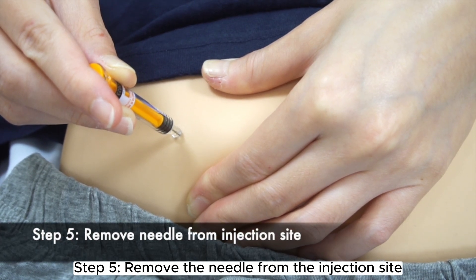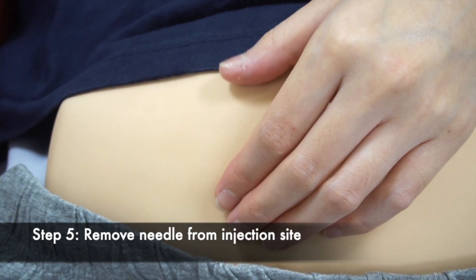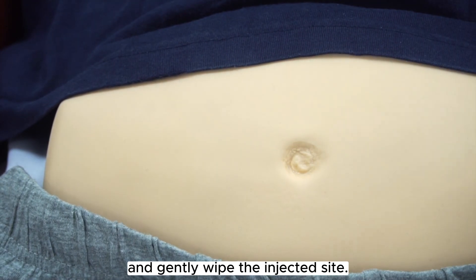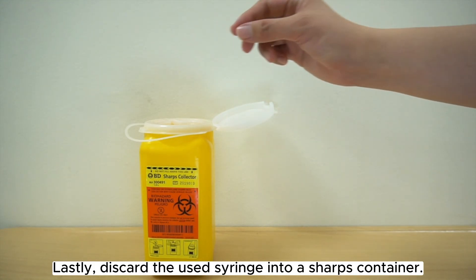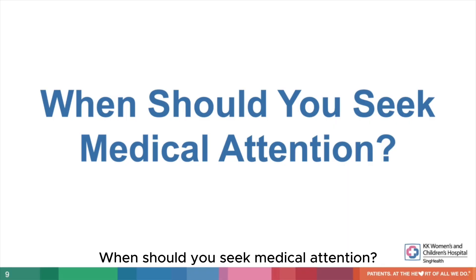Step 5. Remove the needle from the injection site by pulling it straight out. Use an alcohol swab to apply light pressure and gently wipe the injected site. Do not rub the injected site. Lastly, discard the used syringe into a sharps container.